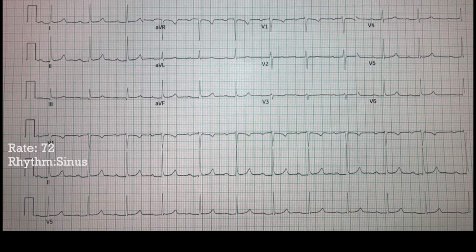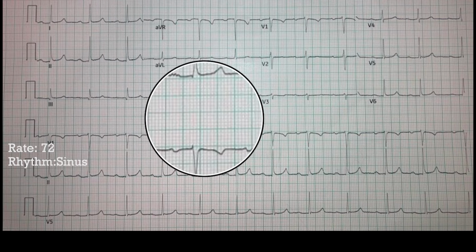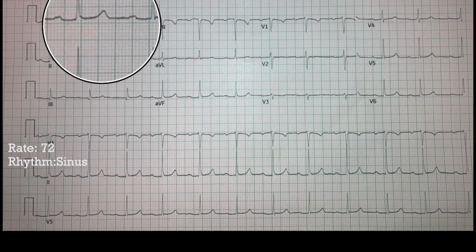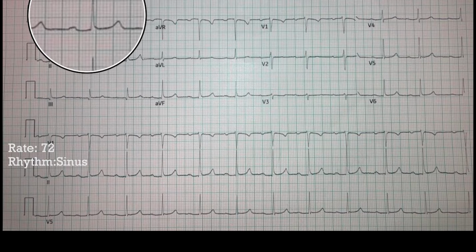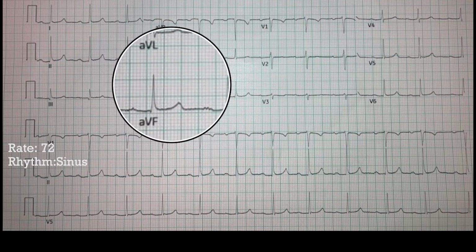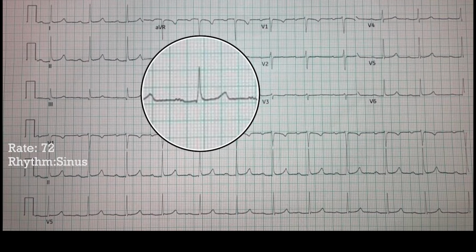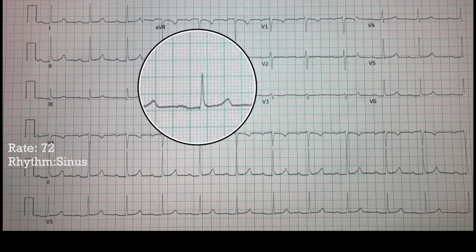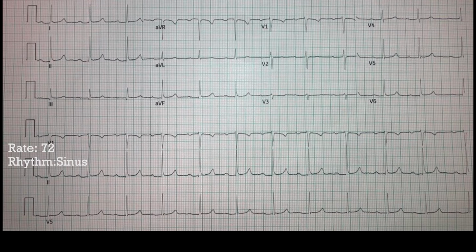Rate, rhythm, axis. If you had to skip axis, you could, but we'll look at it and say that we did it. A lot of people look at lead 1, which is upright, and lead AVF, which is also upright. Lead 1 points from patient right to patient left, so if the main vector of the QRS complex follows along that, it goes right to left. AVF is essentially the middle of the heart down towards the feet, so if it's positive, that means it's going somewhere along that trajectory as well. And so this is going to lie in the normal axis.